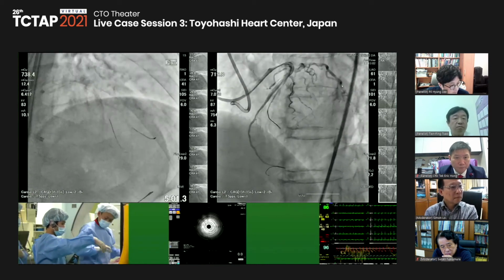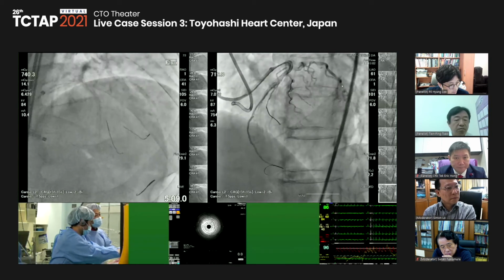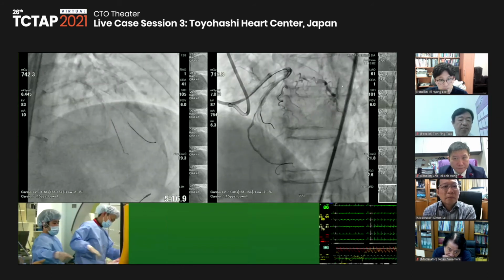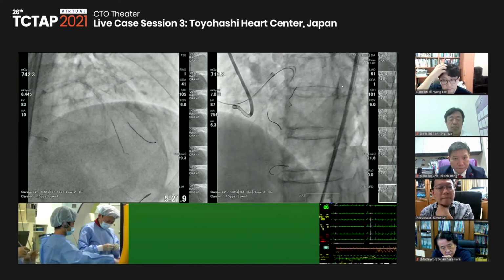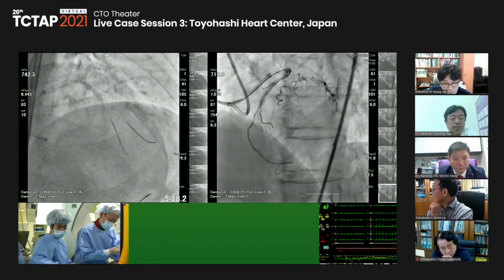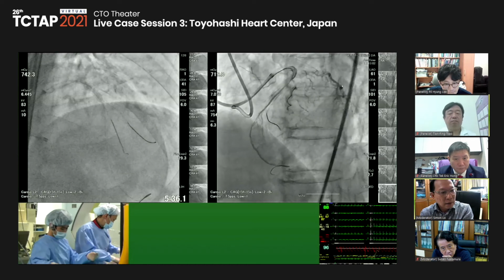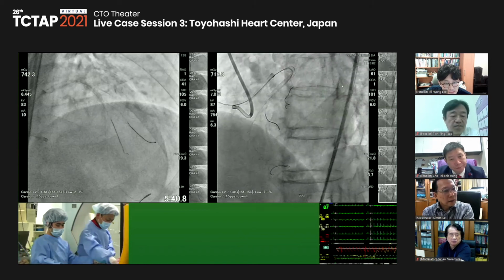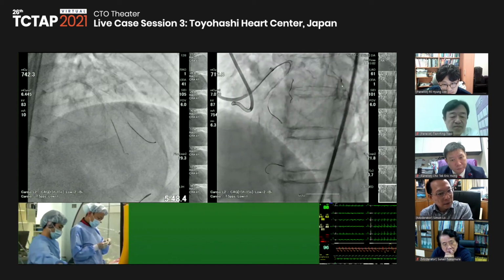So now I can show you IVUS. Maybe you can see some space outside of the stent, the proximal side of the CTO, because we dilated the balloon during the stenting.